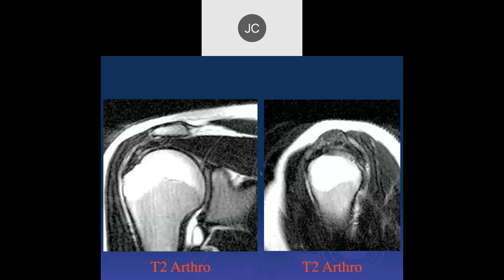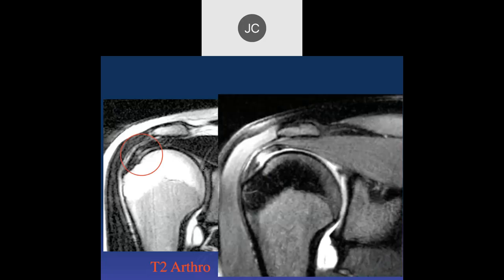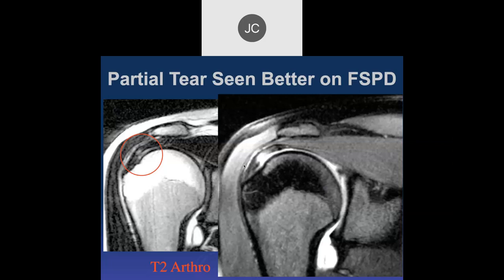It looks like we have a focal area of tendinosis at the junctional zone of the supraspinatus. Here's the T2 and the PD fat-sat. That area is accentuated by the magic angle. But there's a little bit of irregularity here — this patient was arthroscoped and this was a partial tear: an intrasubstance partial tear.